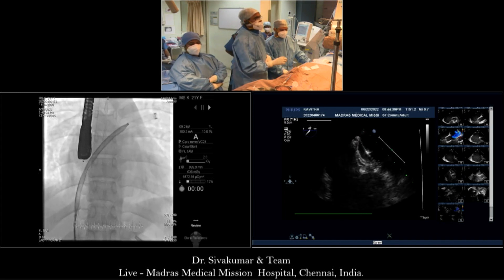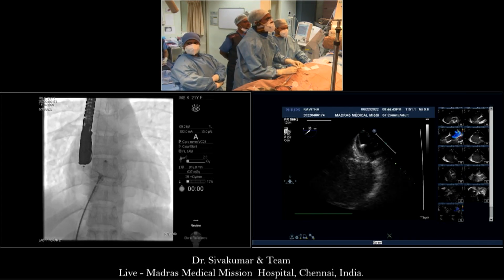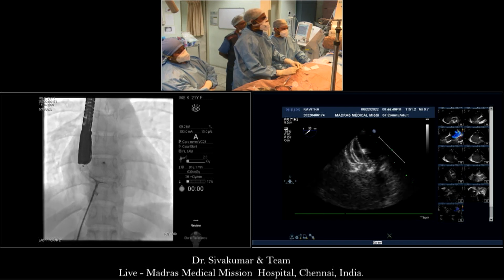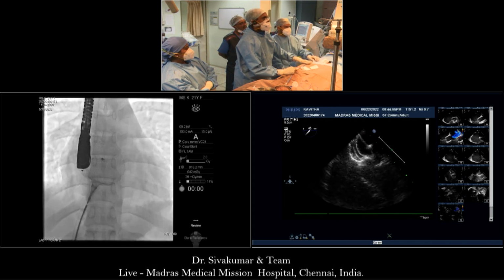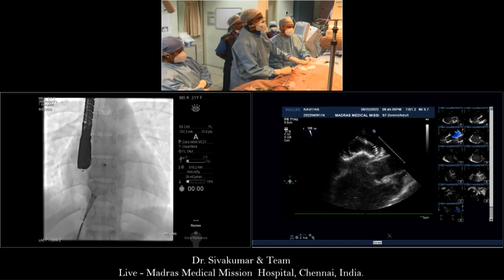Shiva, give it time. Then you can do the Minnesota wiggle as well. Show the mitral valve. It looks okay. It's the same position or slightly worse than the previous one. Is it definitely across the septum, though? That's the question. I'm not sure it fell in the same beautiful way the other one did.